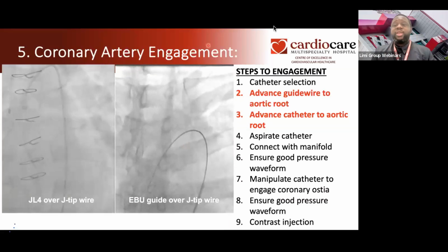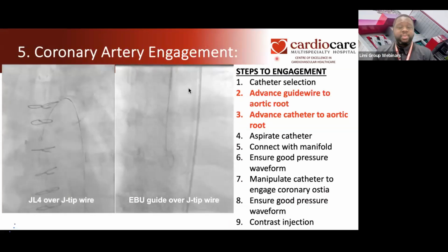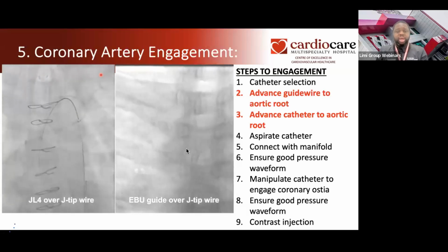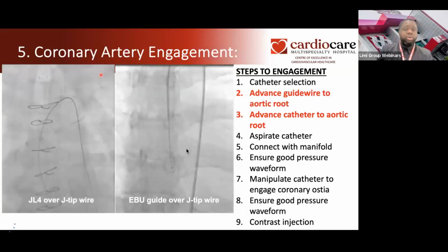I don't know if there are any questions so far, but if you have questions, just put them in the chat box, and I will attend to them very well. Okay, so somebody says, is intra-arterial blood pressure monitoring required during coronary angiography? If yes, how is it achieved? Fantastic question.